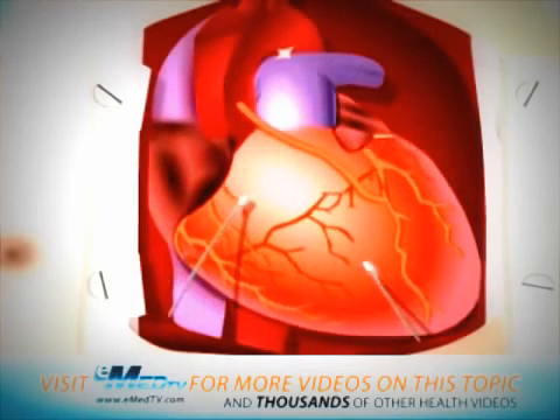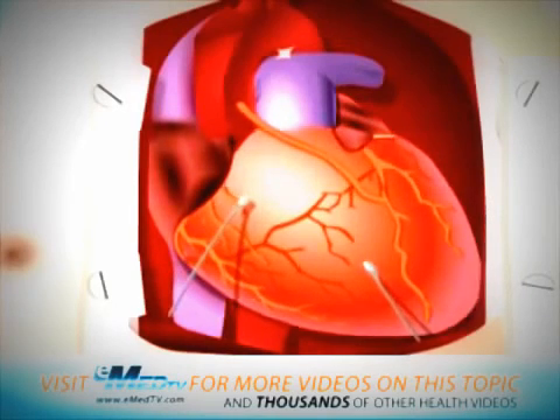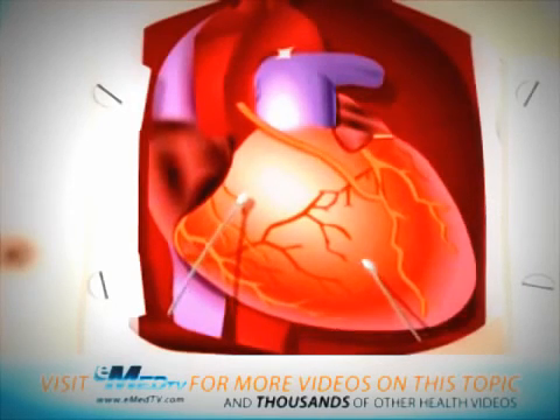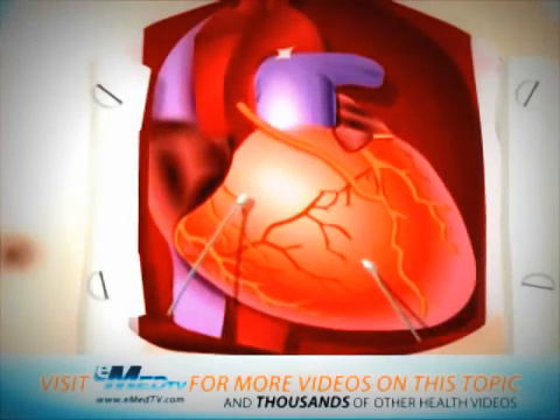These wires are placed directly onto the surface of your heart and will be left inside your chest during your hospital recovery. Usually, these are temporary and should be removed prior to your going home. But in some patients, the wires may need to be replaced by a permanent pacemaker.